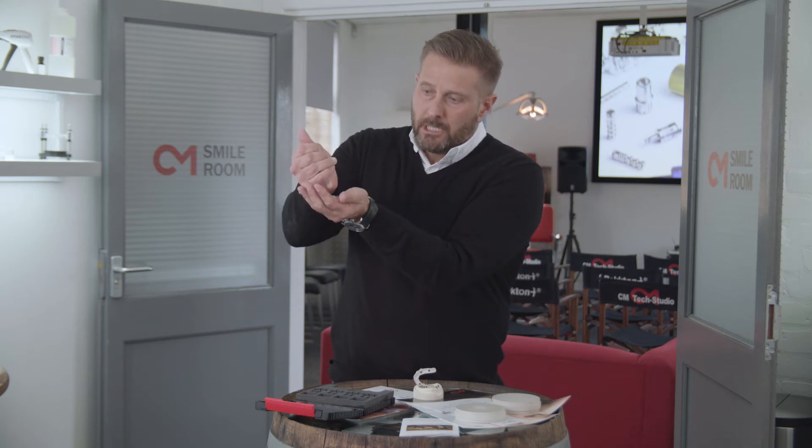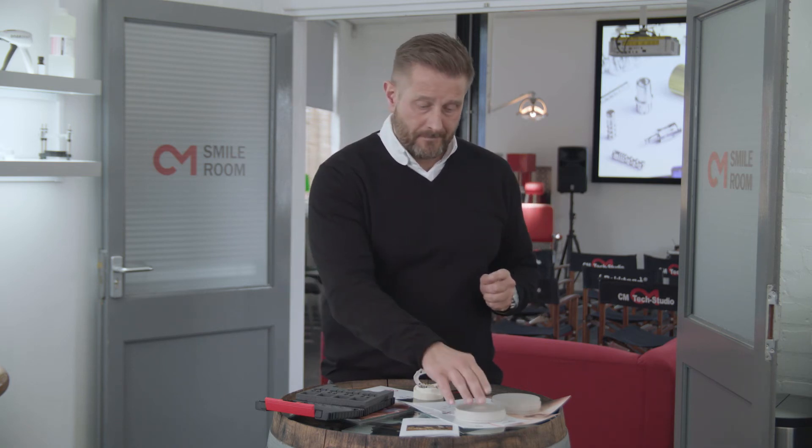Now, how you actually produce your substructures in Pecton — you've got a couple of options. You can press these pellets, you can do it that particular way, but you've got to be careful and really know what you're doing when you're pressing. If you go much above 400 degrees, you destroy the properties of the material, you can even burn it, and you might even get microporosities in your framework. If you want 100% reliability, the way forward is to mill it out of a puck.